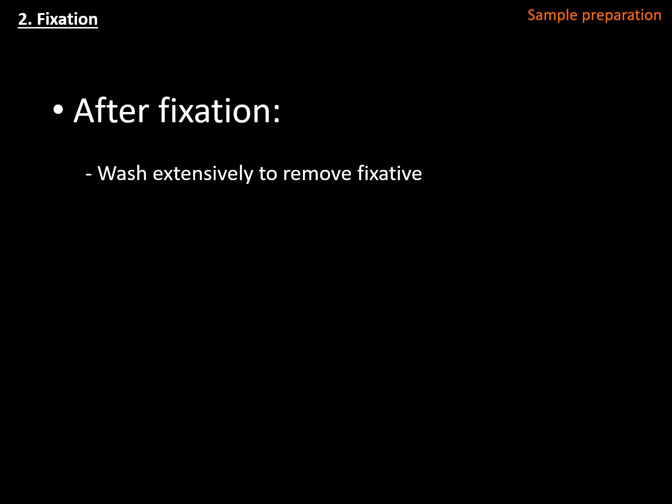Most fixatives are highly reactive chemicals that, if you don't remove them properly, will also react with the reagents you're going to use next, especially antibodies, which are also proteins. And because most fixatives target proteins, if you don't remove all of them, you risk damaging those reagents and not having the results that you are expecting.